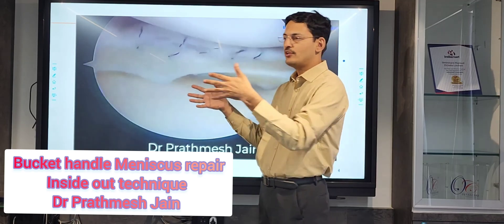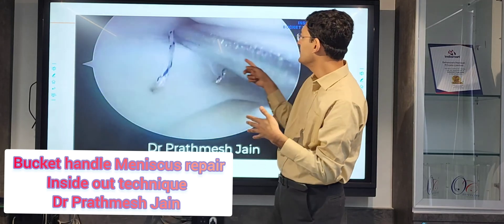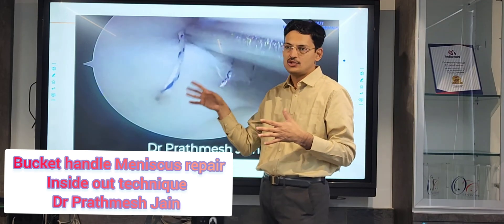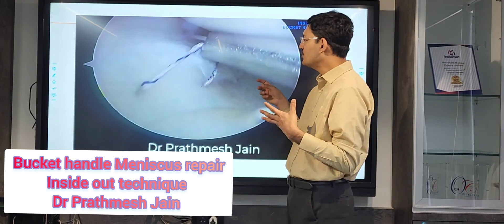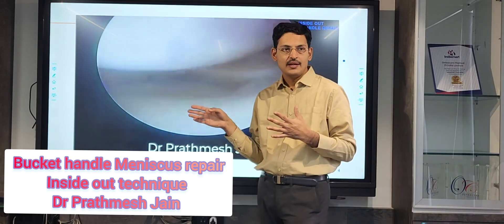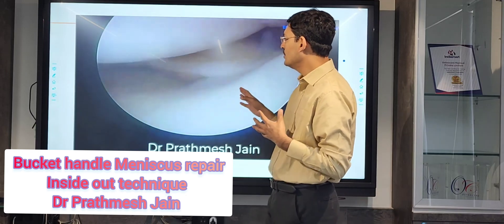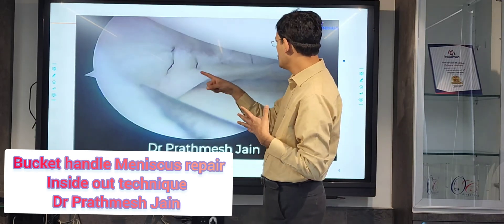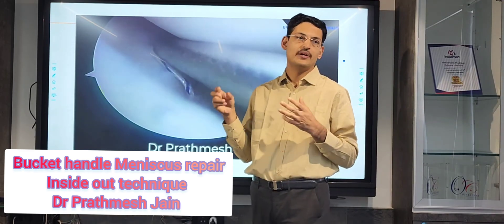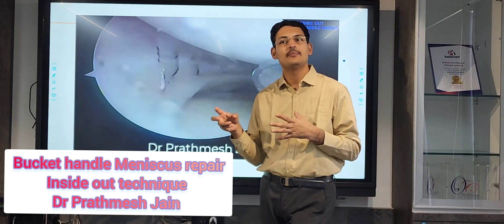You want all the sutures to be exiting at one particular point. After putting all the sutures, the meniscus is repaired in a very strong fashion. The strength of repair with this inside-out technique is the maximum — that is why it is called the gold standard of repair. Any meniscus that is badly torn with poor tissue quality will benefit most from this repair, and the rate of re-tears will be minimum.